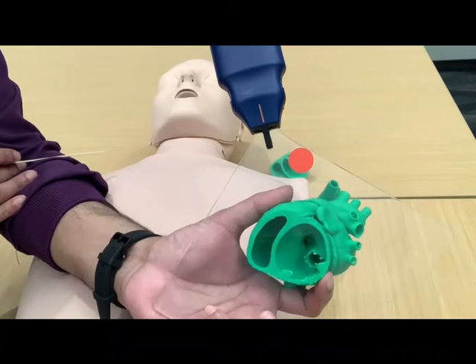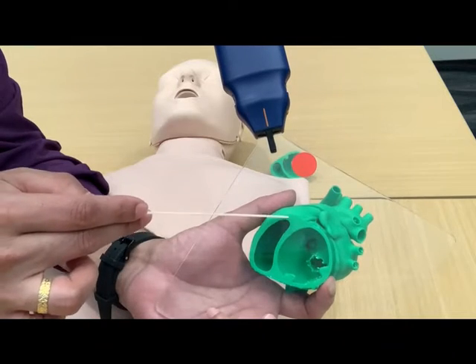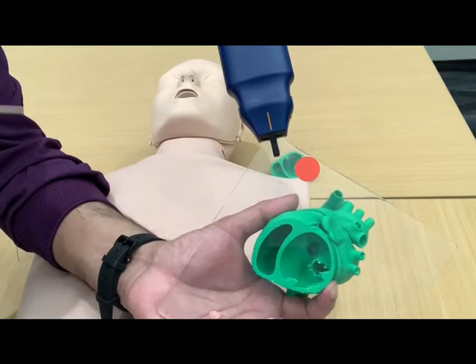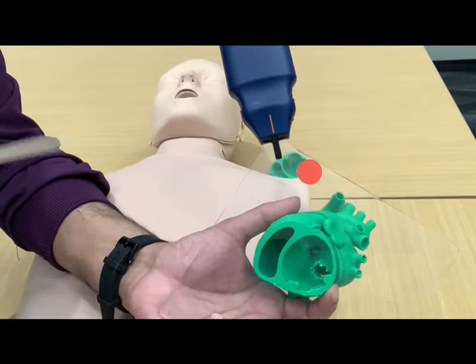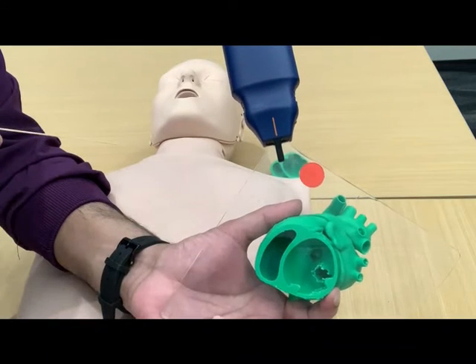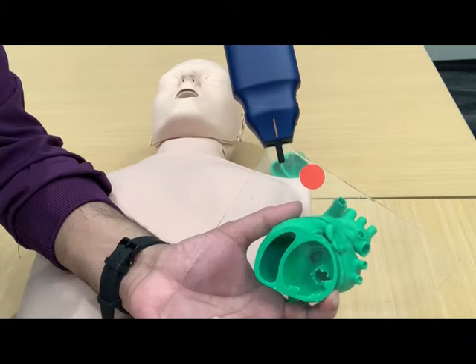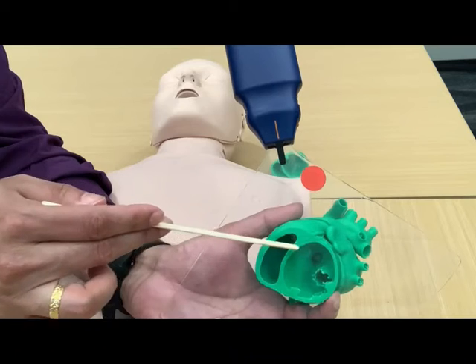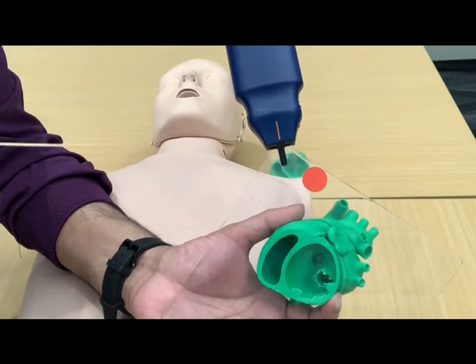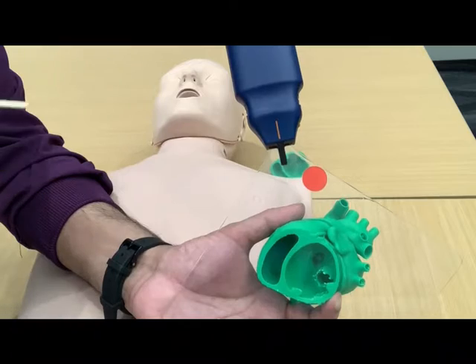Let us identify the structures on the parasternal short axis view. This round chamber is the left ventricle, and the semilunar chamber here is the right ventricle. These two blebs are papillary muscles when the beam is slicing at the mid-ventricle level: this is the anterolateral papillary muscle and this is the posteromedial papillary muscle. From the same intercostal space, if you tilt the transducer slightly superior, you would see the mitral valve in the middle of the left ventricle — you would clearly see the anterior and posterior leaflets of the mitral valve.